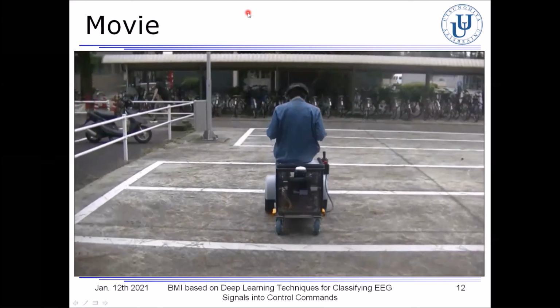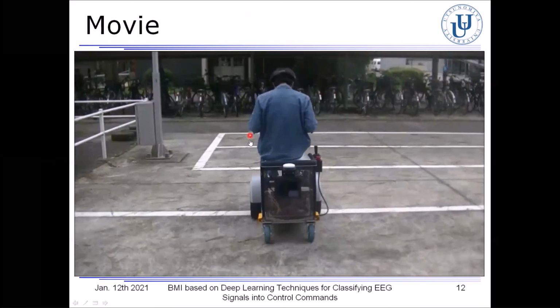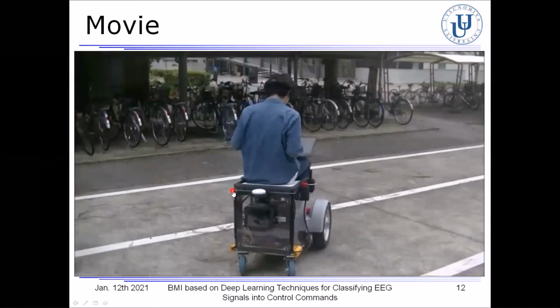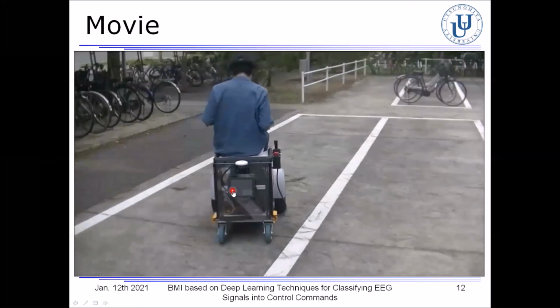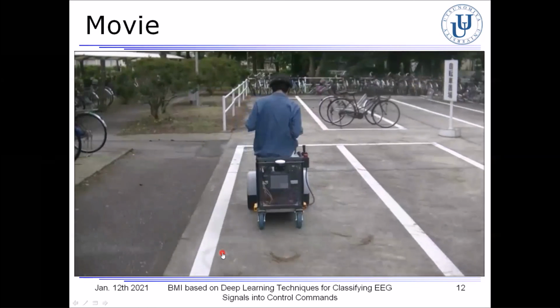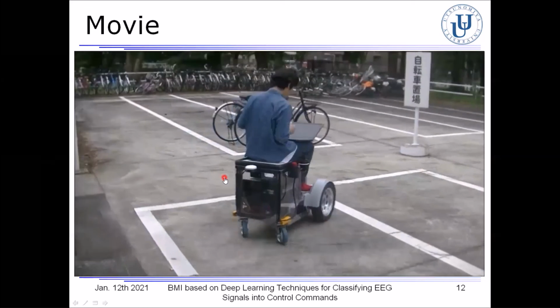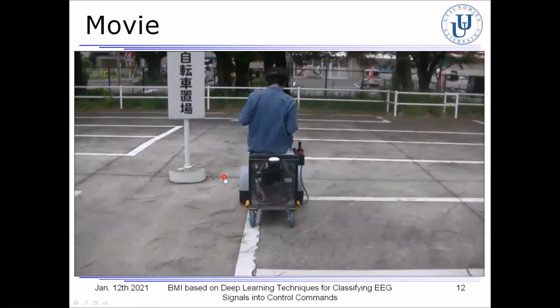Okay, here let me show you a movie in which the user is controlling the PMR in the clockwise direction. At the initial position, the user faced to the front and concentrated on moving the PMR in the forward direction. Around each corner, the user faced to the right in the clockwise direction. And finally, the user relaxed to stop when the PMR arrived at the initial position.